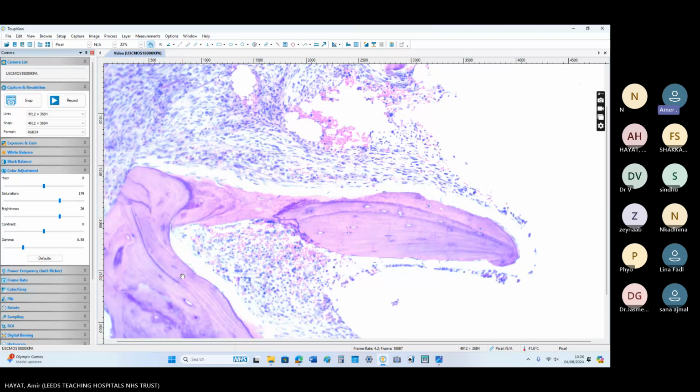Peritrabecular fibrosis, Giemsa stain, because Giemsa is the best stain to find mastocytes, bony lesions or bony pain of the patient, pancytopenia: these are all the hints given to you in the exam to diagnose systemic mastocytosis.